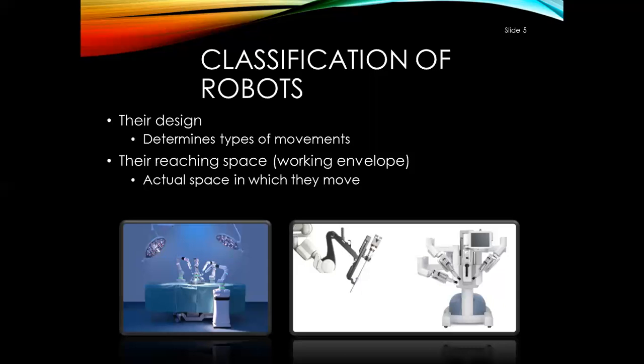One thing you need to understand is servo-controlled robots and non-servo controlled robots. So make sure you mark this down. Servo robot responds through its sensors, whereas a non-servo robot has no feedback or sensing abilities, okay? So these two robots are servo robots, okay? A non-servo robot is one that has no feedback or sensing at all. It just does the work, okay? The Da Vinci system is the one surgical robot system in the United States that's approved for telesurgery. The other one you see here, the Versius or whatever, it isn't approved yet, but it's on its way to being approved.